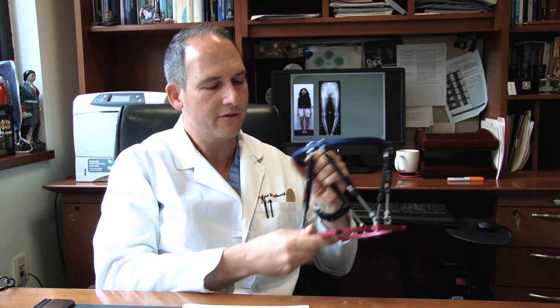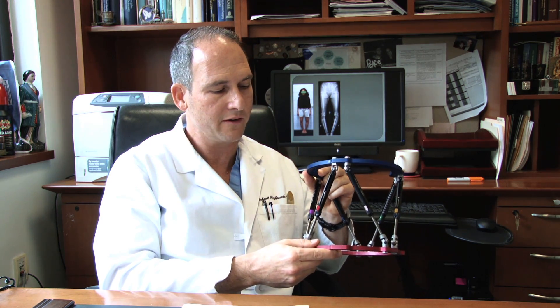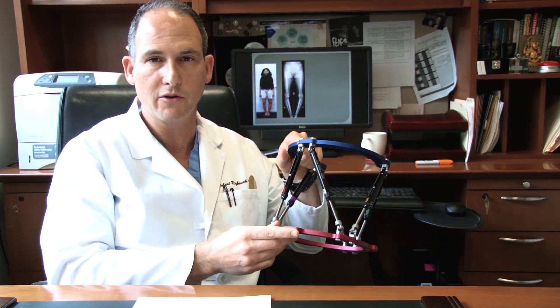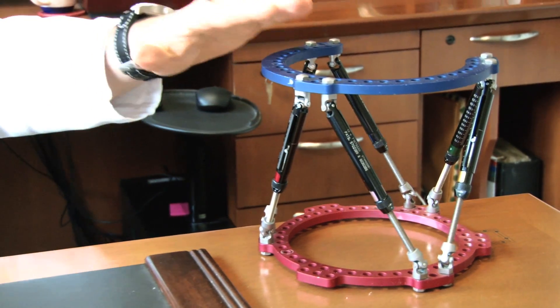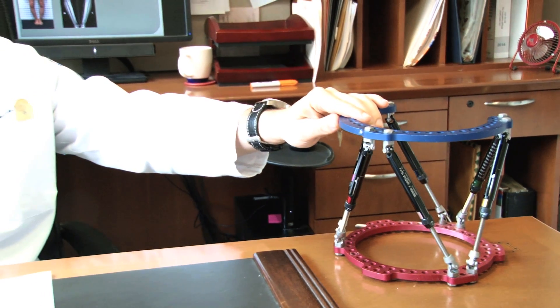We use an external device that looks like this. This is a Taylor Spatial Frame — it's a circular external fixator, and it's just one kind of external fixator that we use. It's the most common one I use on procedures involving the leg or ankle, and it's a very common tool for this type of deformity correction.